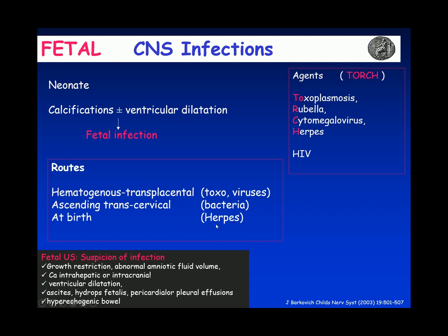So if you do fetal ultrasound, what are the findings that are converging to the presence of infection?